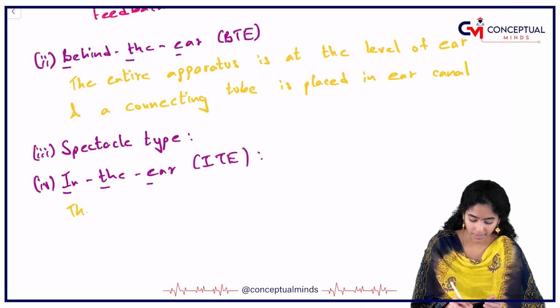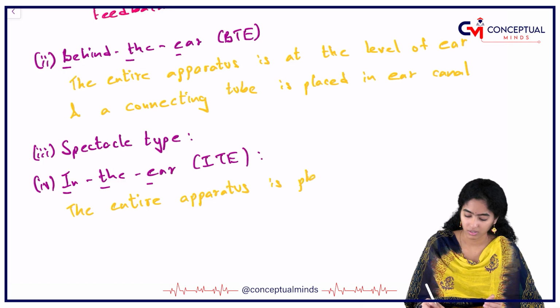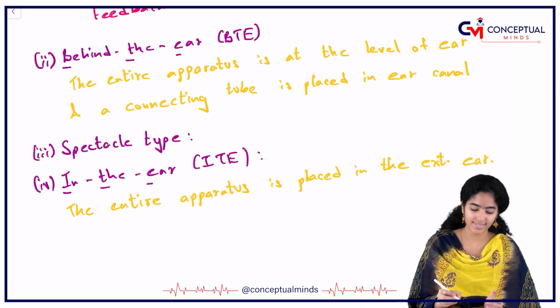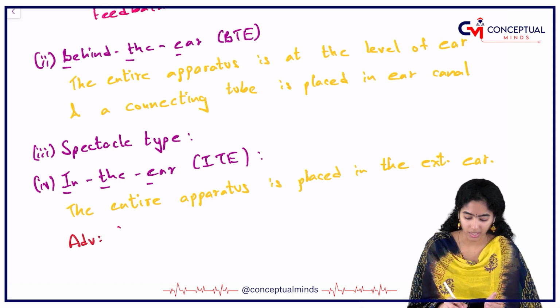The entire apparatus is placed in the external ear. What is the advantage with this? It is cosmetically appealing.